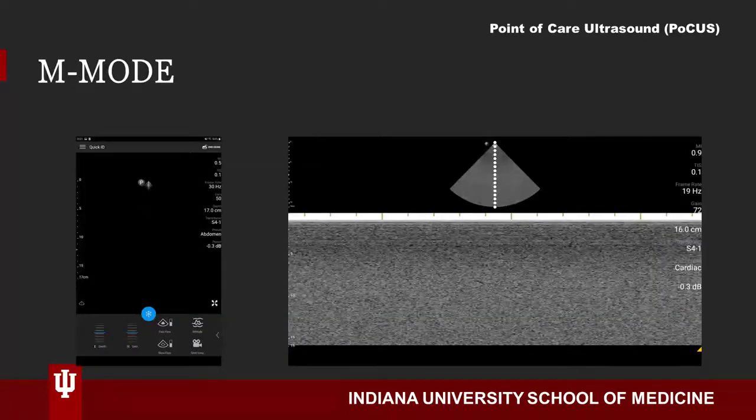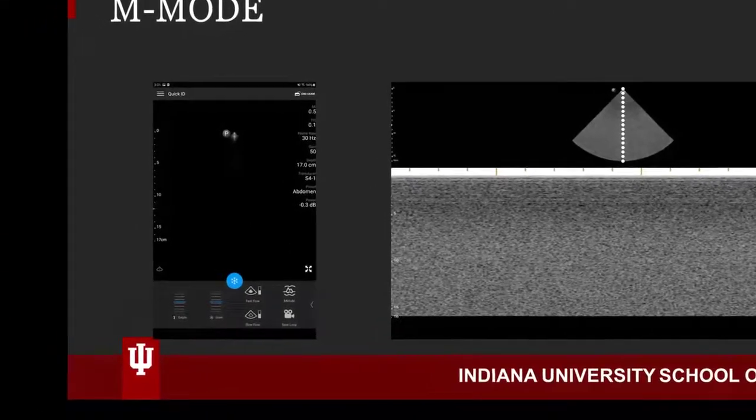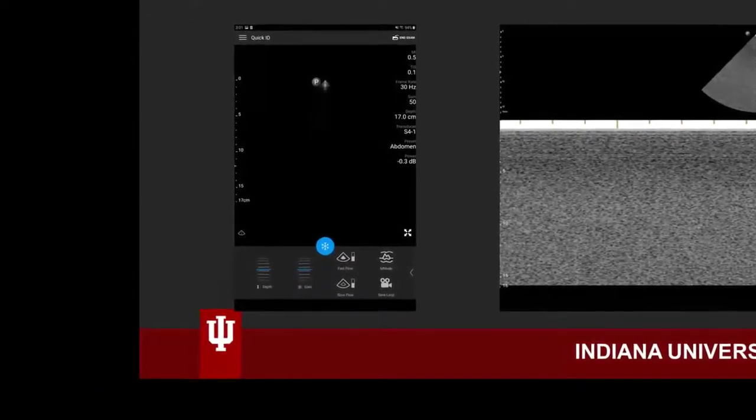The final feature we will visit are the various Doppler options. Fast flow Doppler is designed for large vessels with high velocity flow, such as common femoral, aorta, or carotid arteries. Slow flow will better be suited for smaller vessels with slower velocities, such as the portal or peripheral vessels. M mode is ideal for detecting pulses or heart rates.